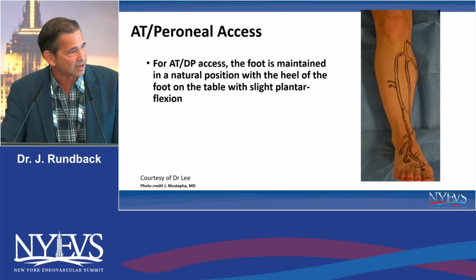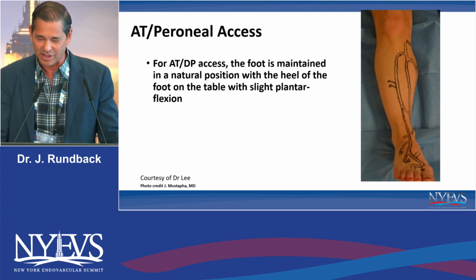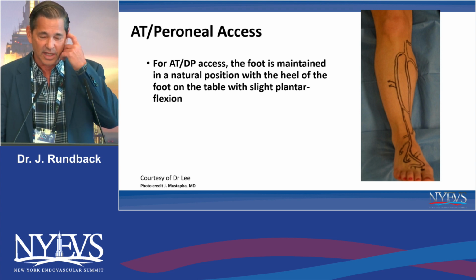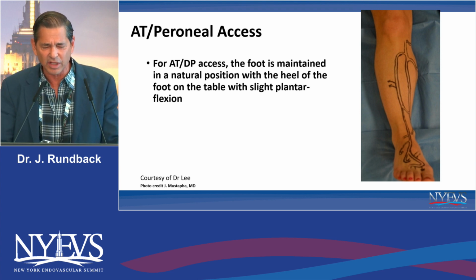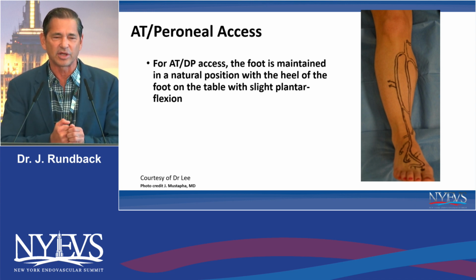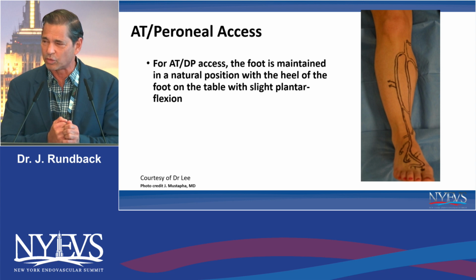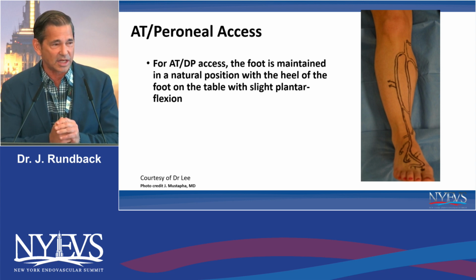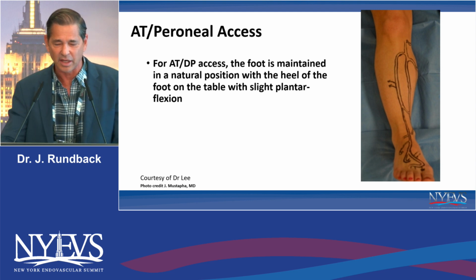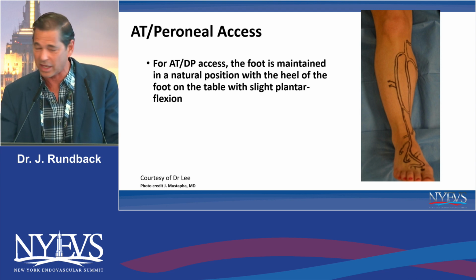So here we get to Dr. Lee's slide set. He's taken the effort to draw out these pictures of the normal anatomy in the foot and how you should do this. You really should just do what you're comfortable with. Make sure the table's at an appropriate height, that you have room under the II to work, you can angulate the tubes and not interfere, and you can see the II and the monitor. So all these play into your consideration about how you're going to do this.